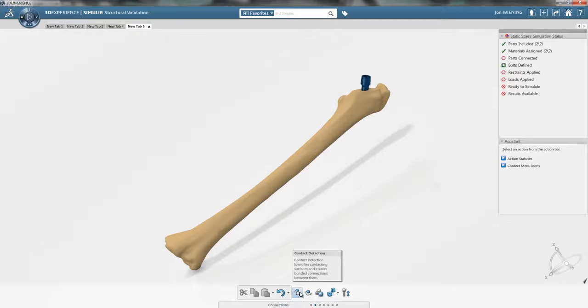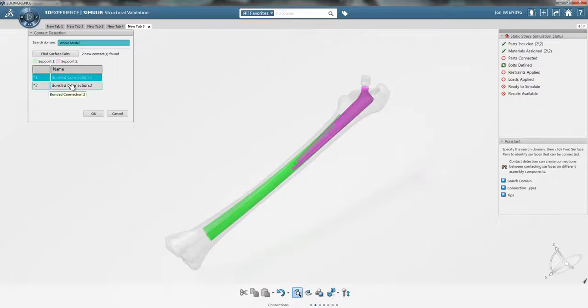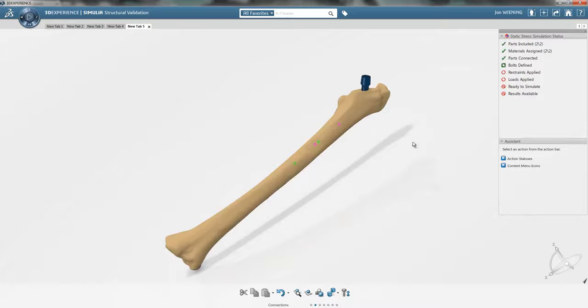I want to set these up using a bonded interaction, so I'm going to use the automatic detection tool to find pairs of surfaces that are touching, and then I can determine if I want them to have a bonded connection. In this case, I want both of these surface pairs to behave as if they're completely bonded because it's a cemented kind of connection that's actually occurring in the model.